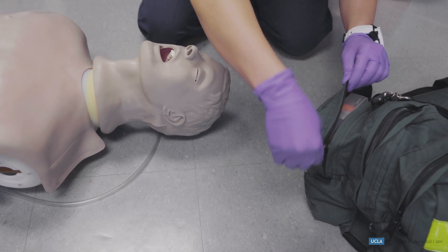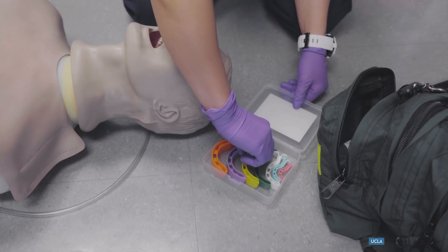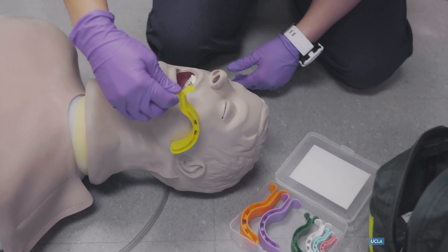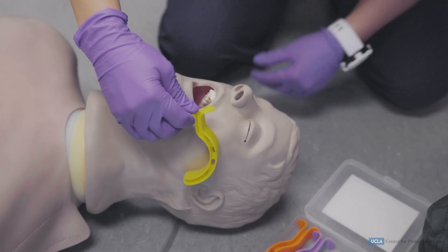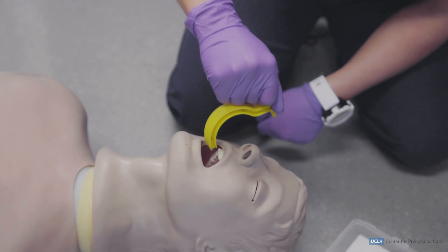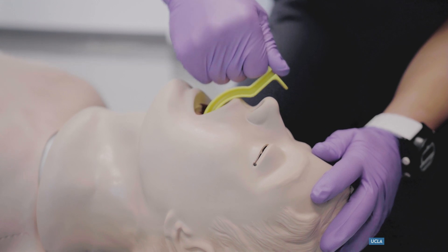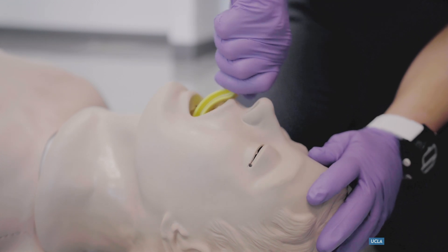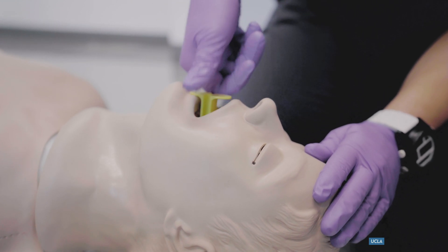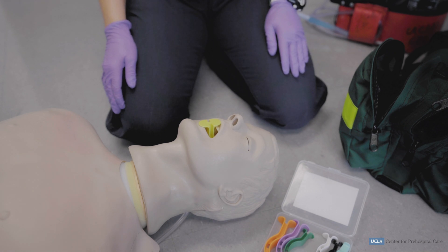She takes an oropharyngeal airway and measures the appropriate OPA for the patient by measuring from the corner of the mouth to the corner of the jaw. To insert the oropharyngeal adjunct, place the tip facing upwards toward the hard palate of the mouth. Insert into the mouth until it reaches the back, then turn 180 degrees and continue downward until flush with the lips. No gag reflex present — the patient accepts the OPA.